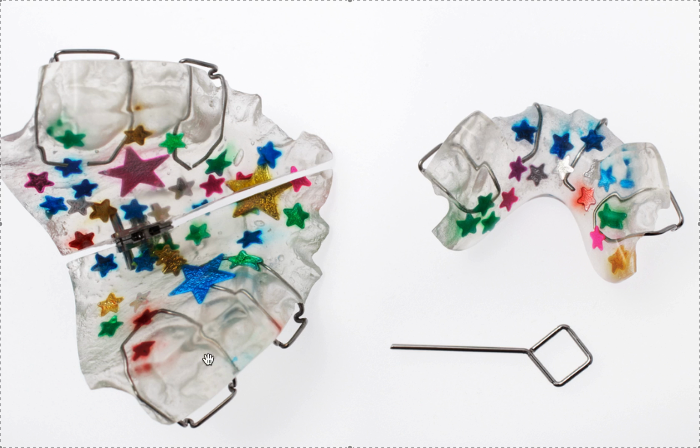You will often see a posterior open bite that develops because you're wearing it for about a year. So that's normal. Once you discontinue them, the bite will fix. You'll put on the braces to fine tune it, no problem. But you often need to chase these with braces or Invisalign or aligners. So this is just fixing the bite and making a little more space. It is not making it ideal, okay? So don't be shocked if you have a posterior open bite.